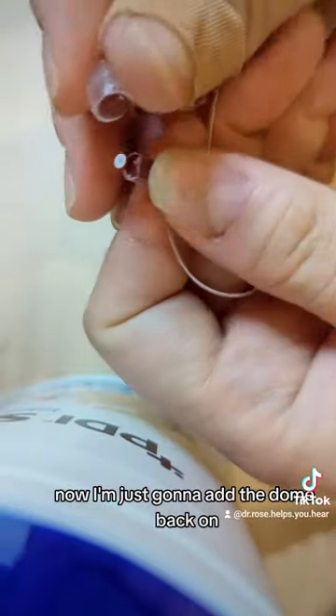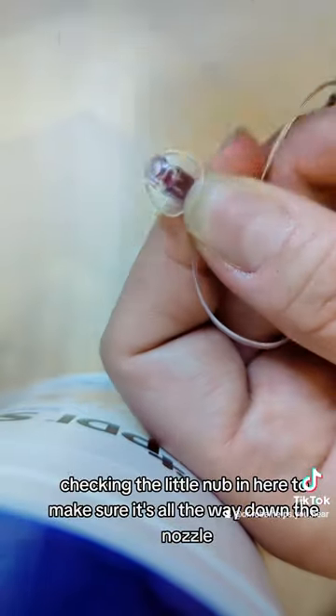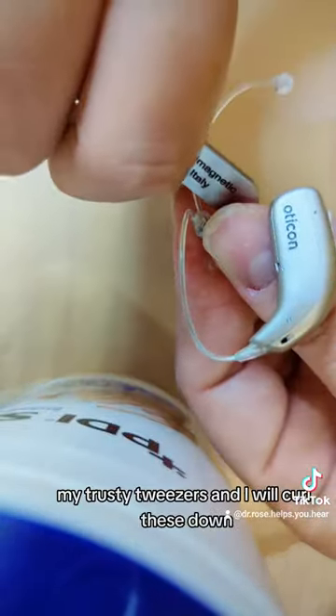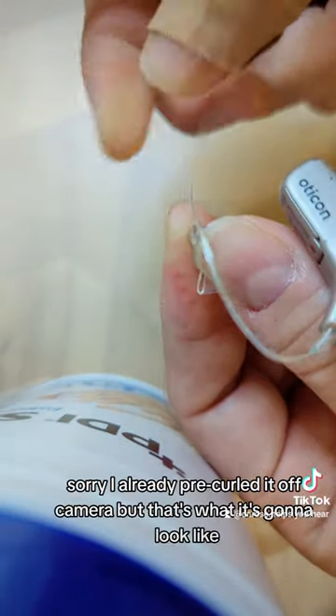Now I'm just going to add the dome back on, checking the little nub in here to make sure it's all the way down the nozzle and on the receiver tight. And then I take my trusty tweezers and I will curl these down. I already pre-curled it off camera, but that's what it's going to look like. It's ready to go.